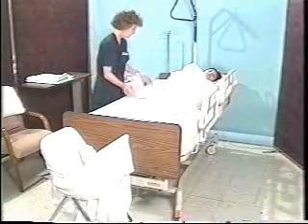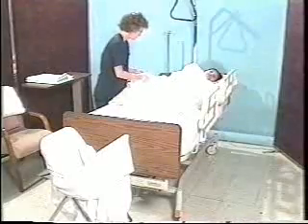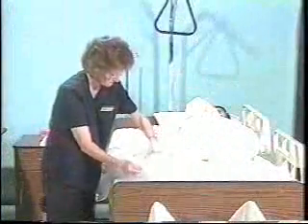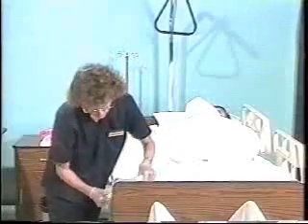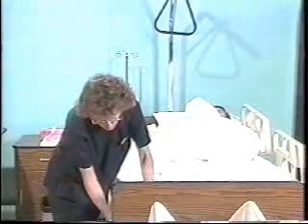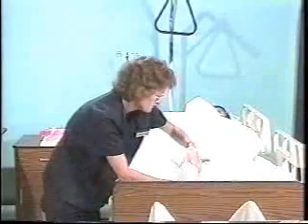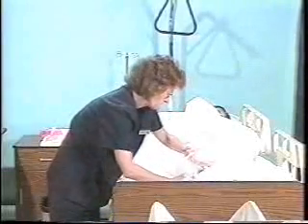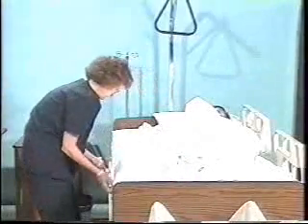The caregiver places clean linen on the bottom of the bed in the same manner as the unoccupied bed. This time the caregiver will use a fitted bottom sheet. She places the bottom sheet on, pulling the fitted corners over the top and bottom of the mattress. She then tucks in the side and folds the extra towards the patient underneath the soiled linen.